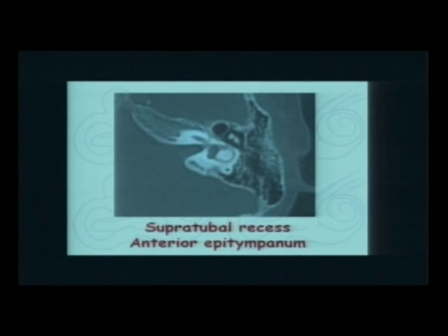This is the lateral semicircular canal, the vestibule, the internal auditory canal, facial nerve labyrinthine part, geniculate ganglion, tympanic part, superior vestibular nerve and a small Bill's bar right there, posterior semicircular canal. This is the vestibular aqueduct, and here this is the highest part of the cochlea. It's nice anatomy. Okay, but why do I put this slide there?